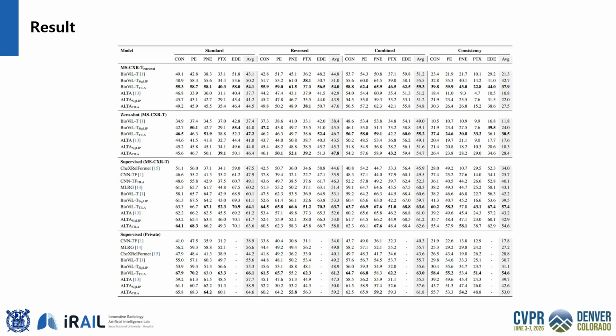In zero-shot, TILA improves over the baselines, and combined scoring adds a further boost. In the supervised setting, TILA improves standard accuracy, the clinically relevant metric, on both backbones, and combined improves it further still. The reverse and consistency gains tell us why. The model is now genuinely reasoning about temporal direction, not just exploiting label priors.